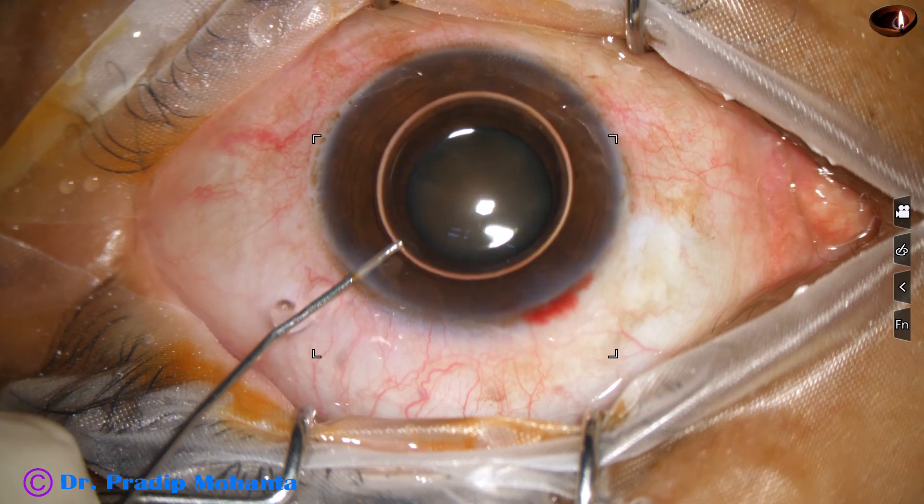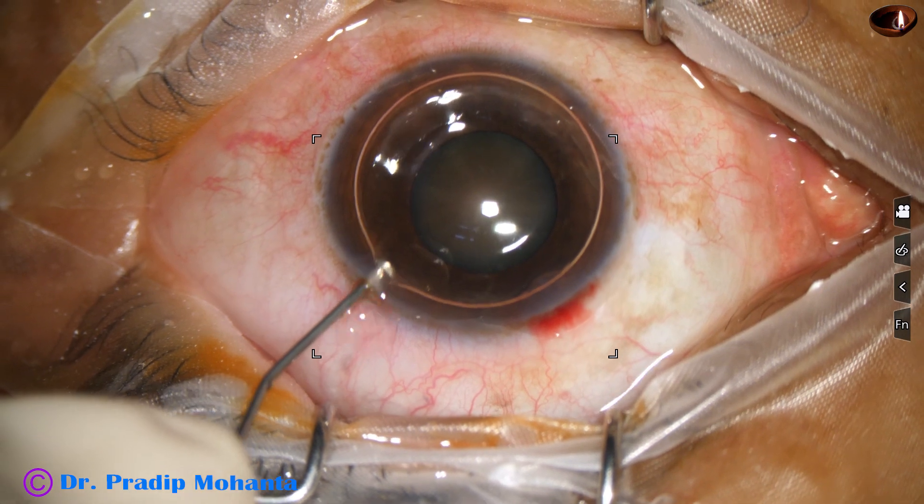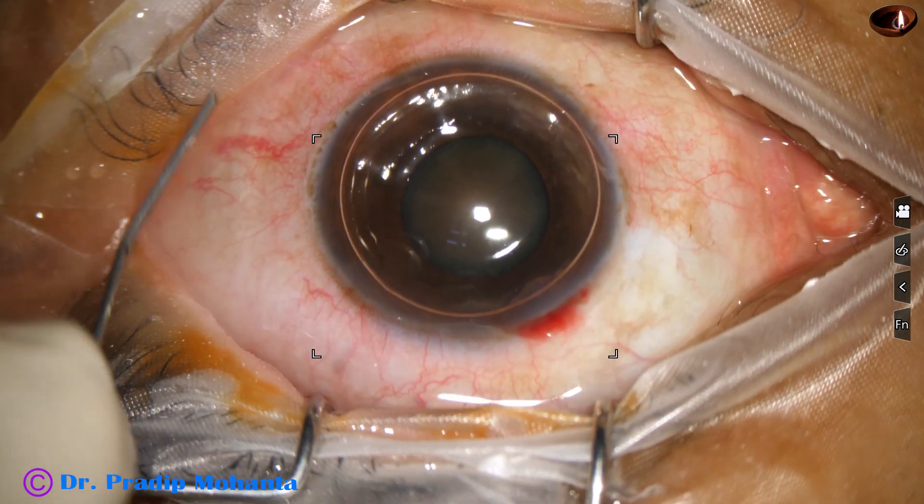An air bubble is injected. Beneath this air bubble, trypan blue dye is applied over the anterior capsule.